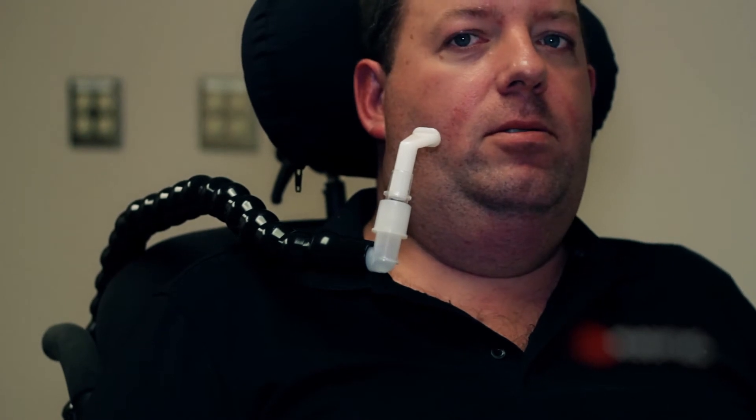Flex the CanVent arm and position the mouthpiece near the individual's mouth without limiting the patient's mobility and vision.